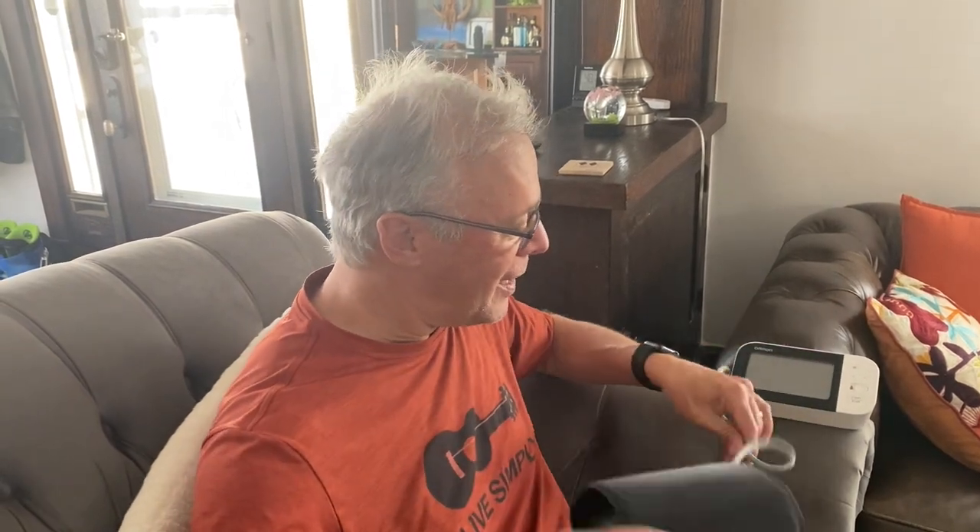However, the problem I've had over many years is that my readings have been inaccurate. I use an Omron machine. I'm going to show you something I learned recently that's going to give you the most accurate readings ever. With my Omron, I was actually getting fairly low readings — it was giving me a false sense of security that everything was fine when it really wasn't. So I did a lot of trial and error testing and found a way to record the most accurate blood pressure readings at home.